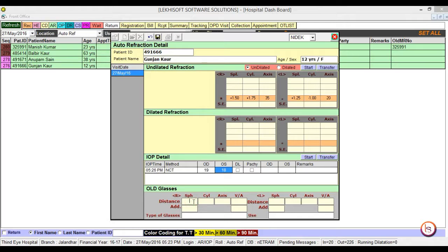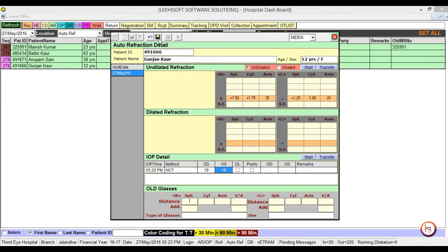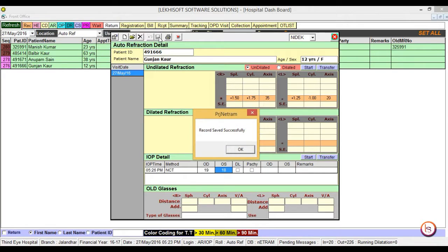This is the old glass data. If you want to use it or leave it as per choice. Click on save button. Now the record has been saved successfully.